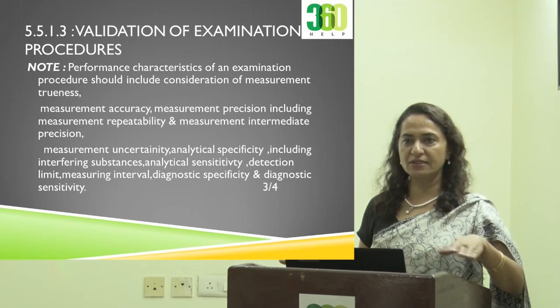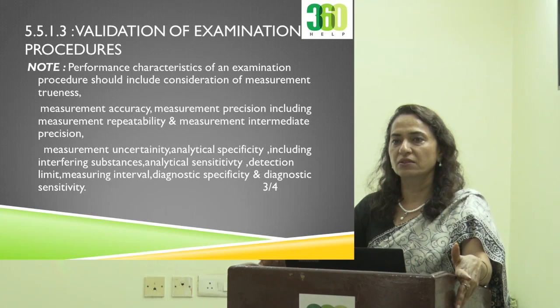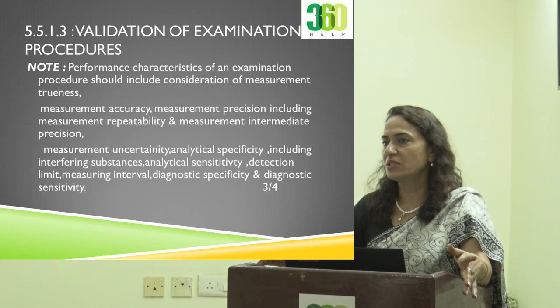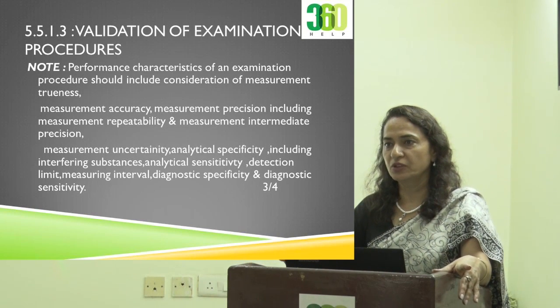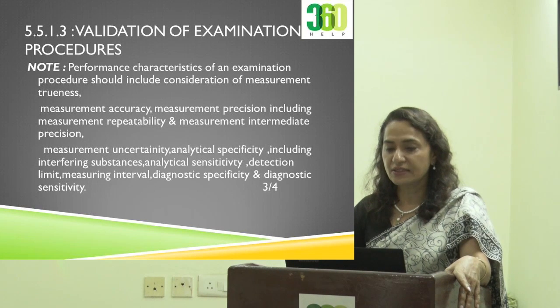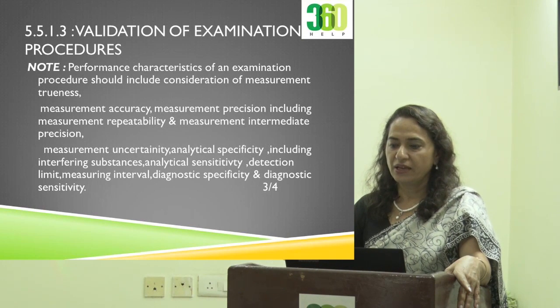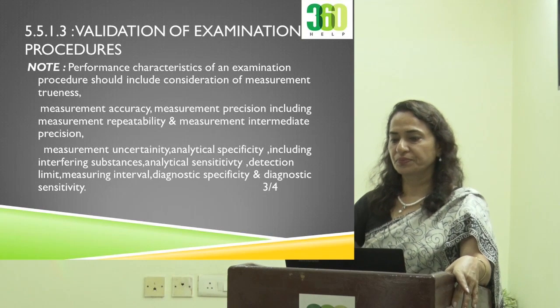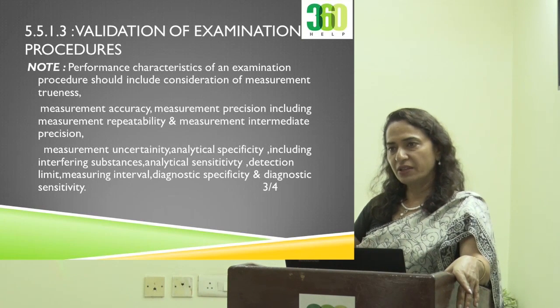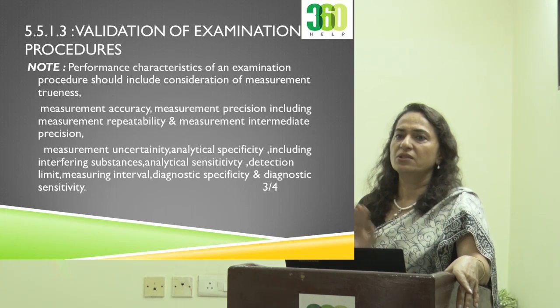So are we doing all these things? Are we checking all these things? No, we are not. So what is advised? Advised is to use a validated procedure. So don't try to invent your own procedures and then land up in problems, because you will not be able to validate and that procedure will not be acceptable. These kinds of validations in detail are done by the research labs. And if you see in your kit materials, all these values are given. Precision value, accuracy, measurement, repeatability, everything is given in the kit because they have already done and defined. What you are doing is just verifying it.